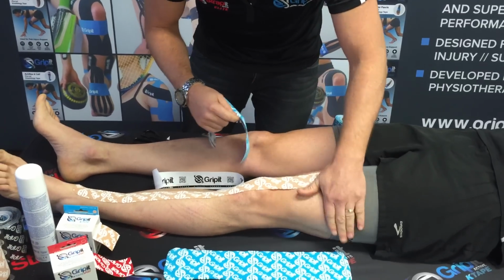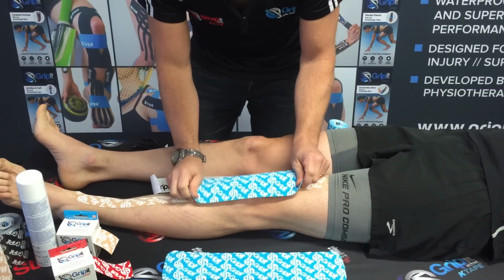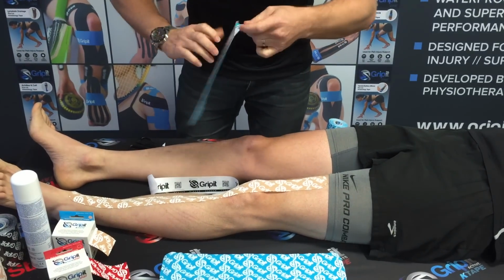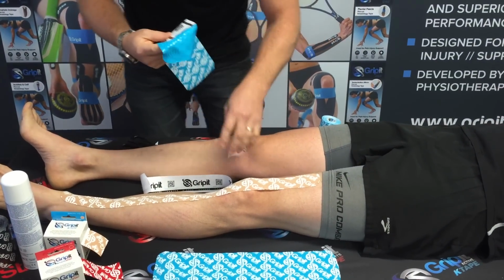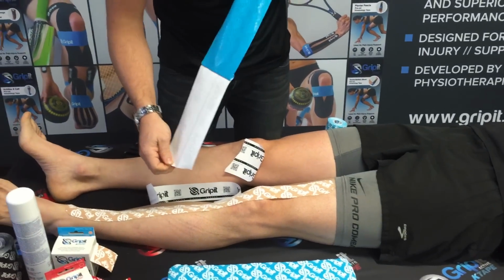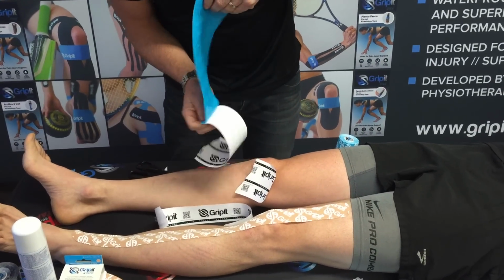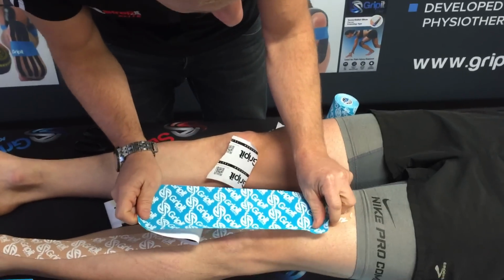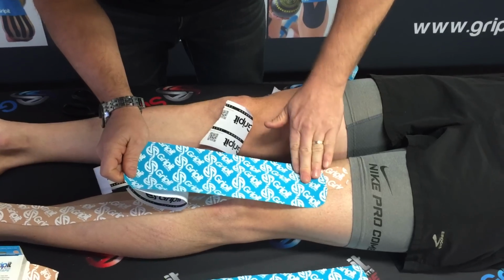But we've got Danny here who's got a big body, and so we want to deload Danny as much as possible. He's about to run a marathon, and so we want to make sure he's heavily deloaded so that a lot of that load that's going through the knee joint is in fact going into the tape. Okay, so here's our second layer. Now I'm going to crank this up, guys.